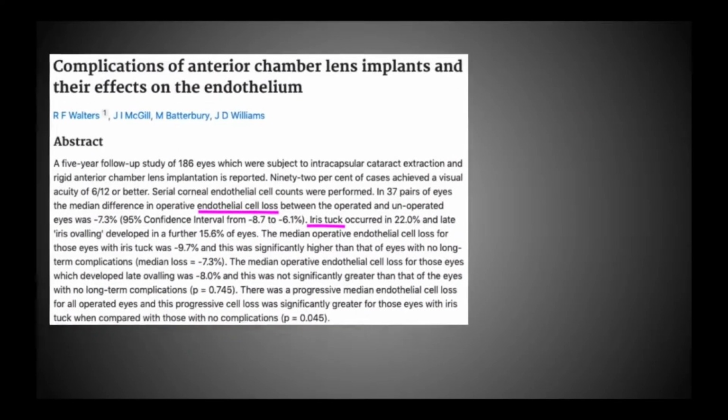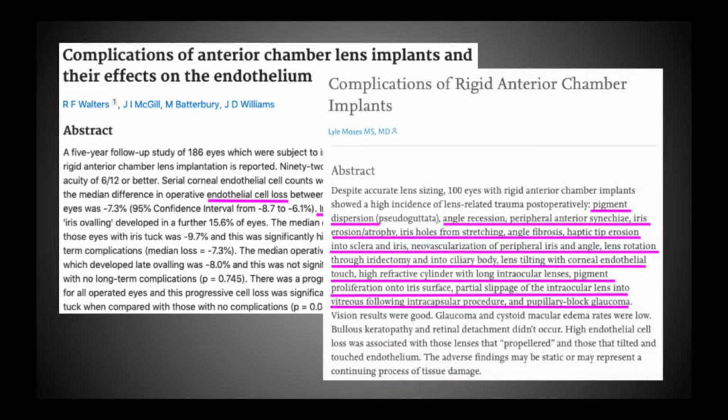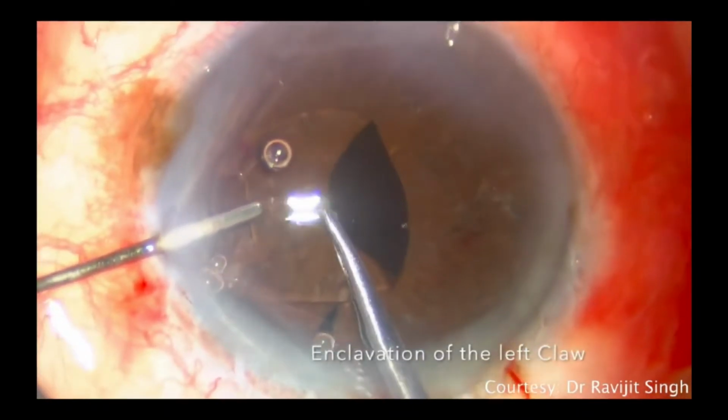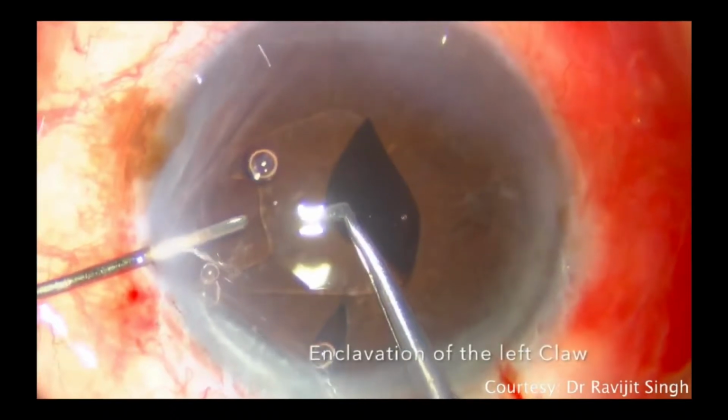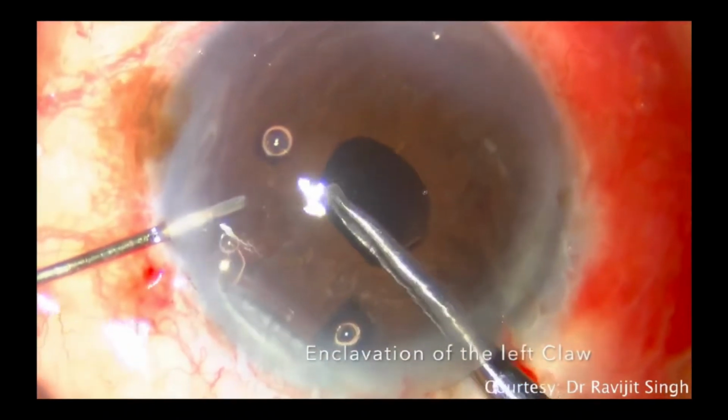Complications of anterior chamber lens are well studied throughout the times. One of the most common complications is endothelial cell loss. Retropupillary iris fixated intraocular lens is a good alternative of choice as it can be performed without much difficulty.